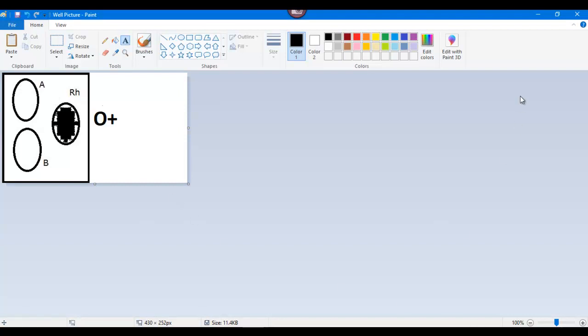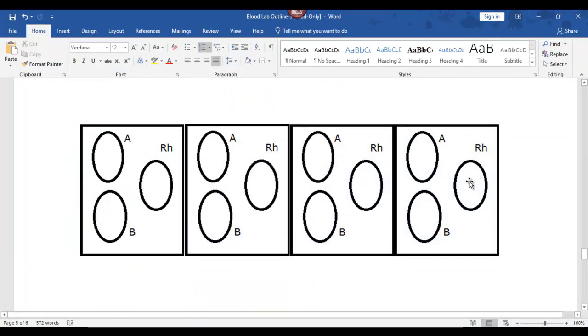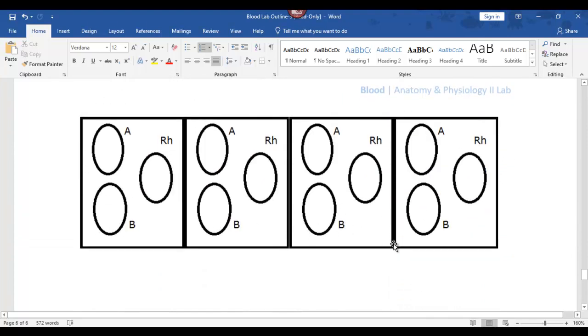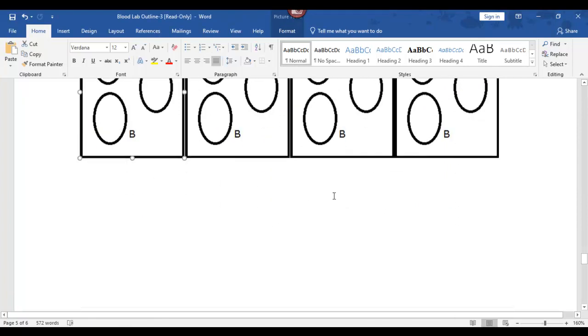Okay, so I hope that helps. If you'll watch this video and fill in, you can just write the corresponding blood type on top. I did split this up a little bit. Be a good thing to study, but you'll have one of these little wells on your exam, at least 2 or 3 questions about something like this. And that's the bottom line, because Stone Cold said so.